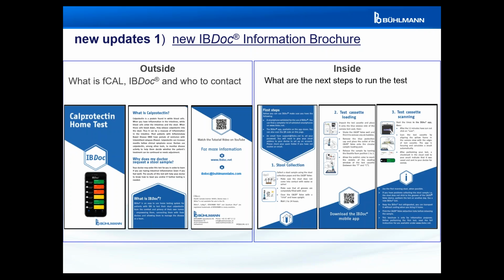So I totally get the point about the weighting and the organizing, getting it down. The app in front of the stool collection is important as well. Yeah, it would almost be really good. I know I've said we use the pictogram a lot out of the kit. However, this is better, isn't it? Because it's got the pictures and the words. It's a shame that this just can't go in the kit rather than having to give them out individually. Yeah, that's true. It would be nice. Unfortunately, that wasn't submitted, so it is definitely meant to have the healthcare professional provide it with the kit. Unfortunately, okay.